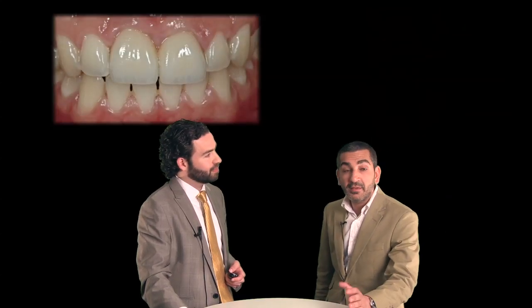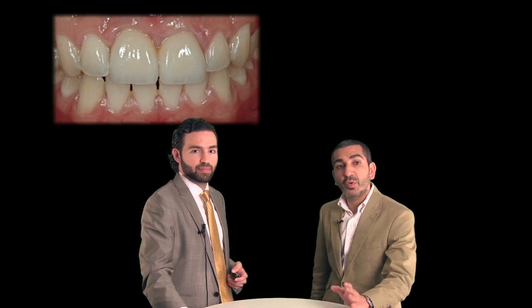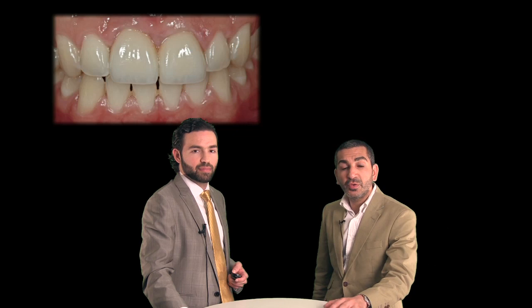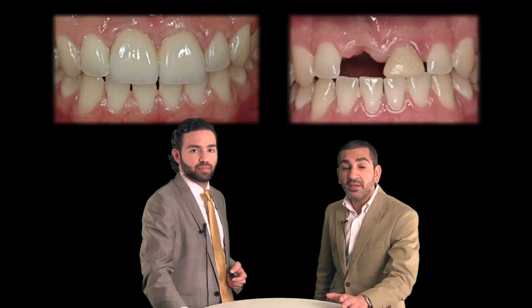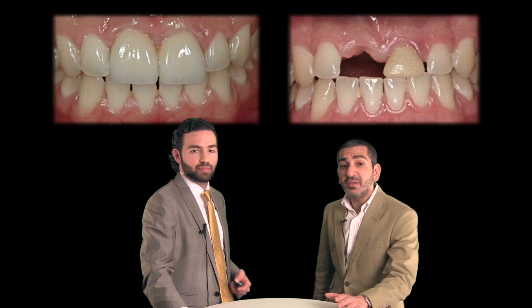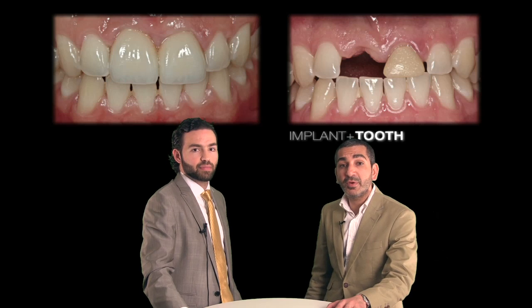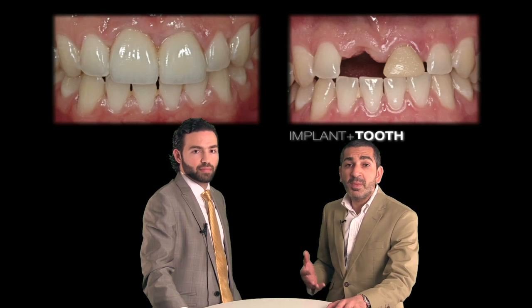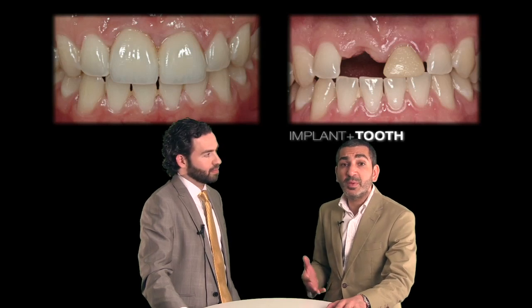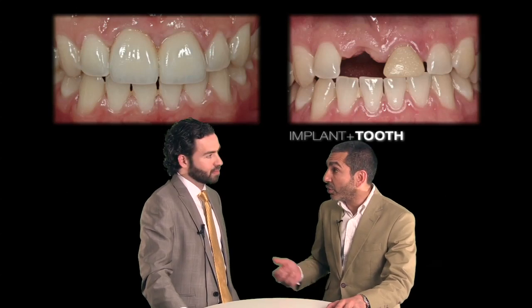You remember this case where we showed you at the beginning 2 central incisors were restored. One was on a natural tooth and the other one was an implant that was restored. Do you remember that? In reality, the simplest way to restore or rehabilitate this patient is really with porcelain fused to metal crown, and that really is the workhorse of our practices. I would say a big portion of my dentistry is PFM based, and I'm not ashamed of it. I'm actually quite proud of it because I know it's predictable. It provides good longevity.